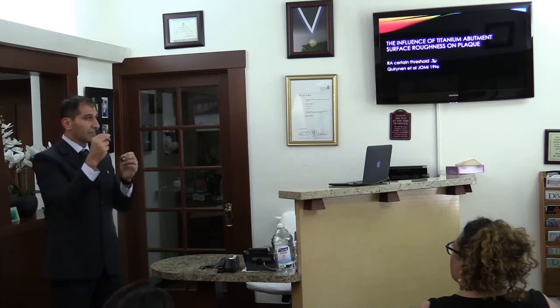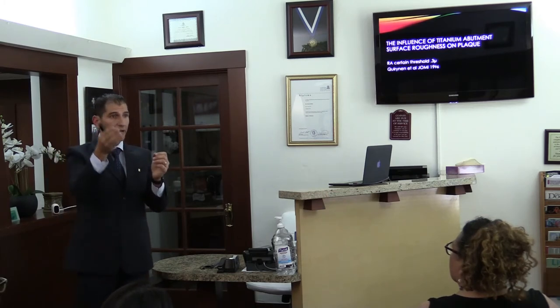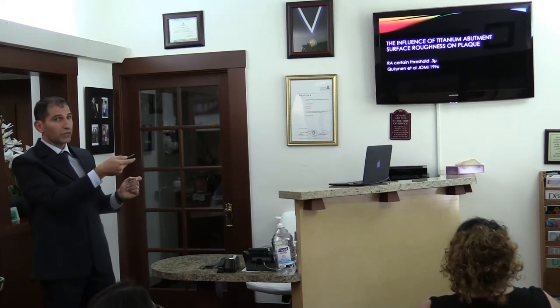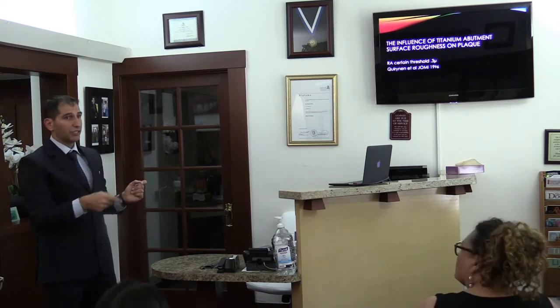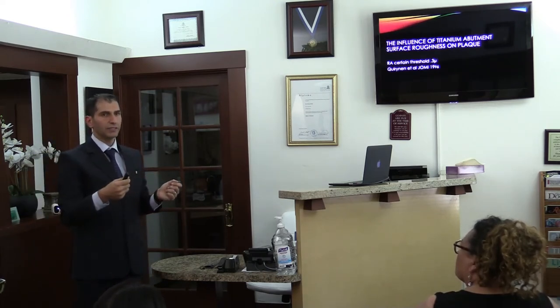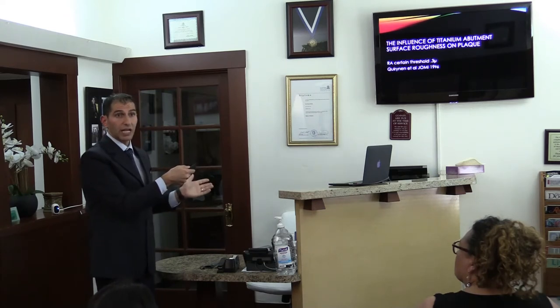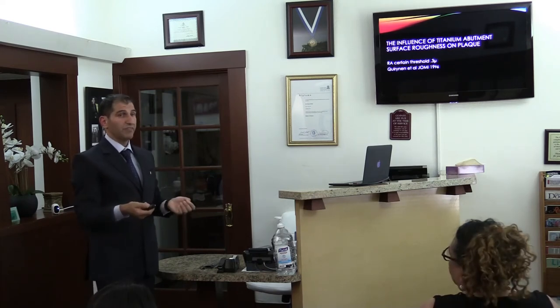So if I have that functional insertion, great. Then if I lose that connection, I'm back to a micro gap. That surface of the abutment is not going to get clean. We're violating the threshold of 0.3, 0.4 micron. When you violate that, you get affinity of microorganisms. But it's the same: if you want to get affinity to cells, you're going to get affinity to microorganisms. So it's a struggle and a dilemma. I'm not sure if I want to use this type of abutment on my patient, and if I want to use it, I want to be very careful.